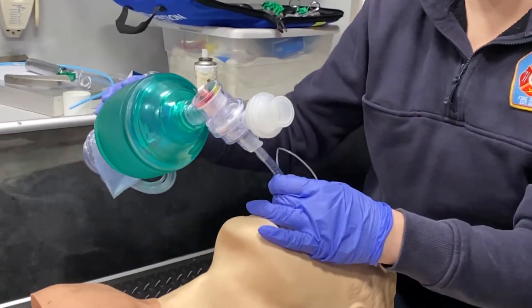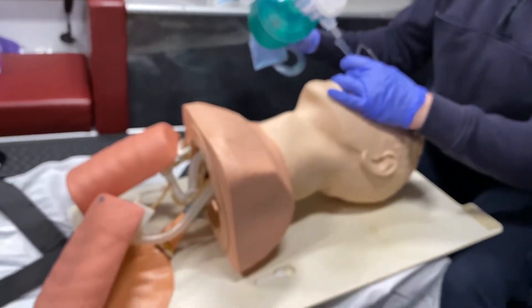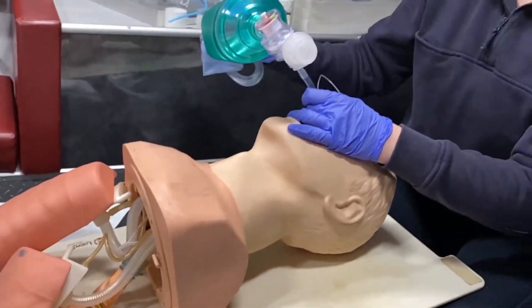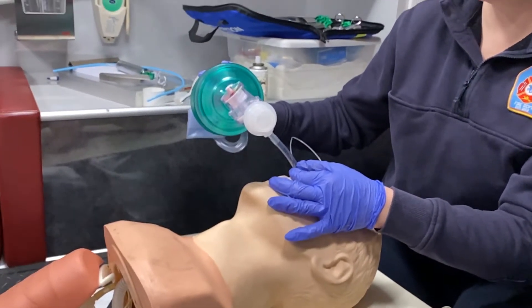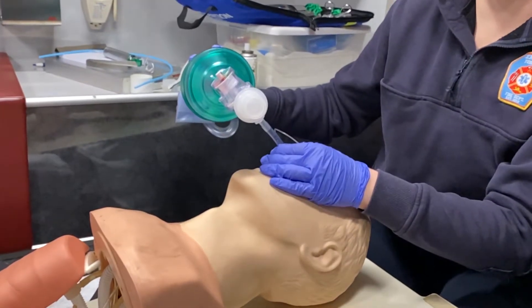You're going to inflate your balloon and then go ahead and start ventilating your patient. We're going to check just like we would a regular intubation — we would have condensation in the tube, and we're going to listen for lung sounds to make sure we have no sound over the epigastrum.